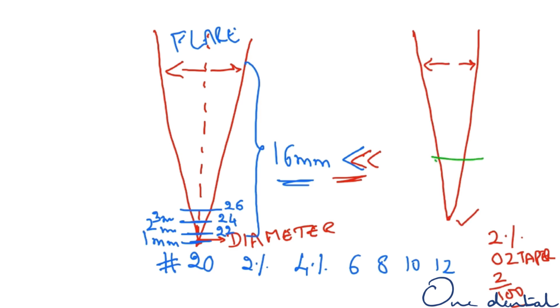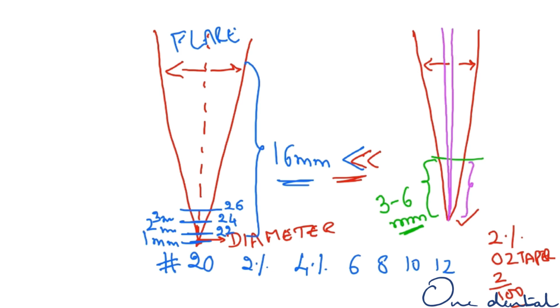Okay, coming back to the length, diameter and taper, I said length you have no choice, diameter you have less choice, taper you have all the choice. Having said that, 2% is not a taper, it's a parallel instrument. It's a non-tapered instrument in a tapered canal, and root canals are always tapered. So what I want you all to understand is, at least land up with a 4% taper. I would prefer a 6 to an 8% taper.